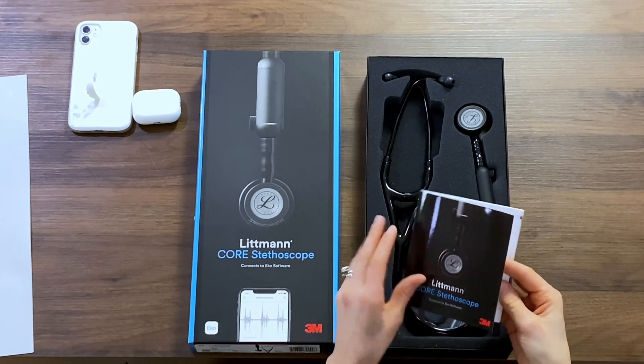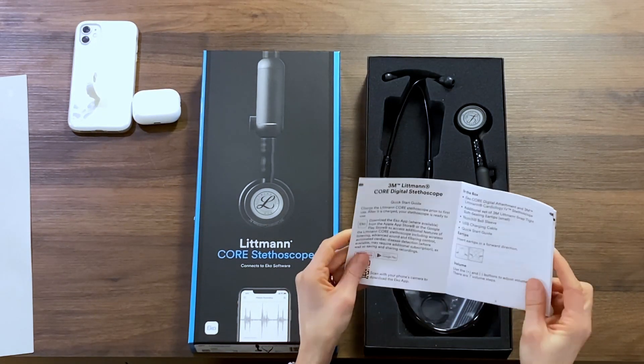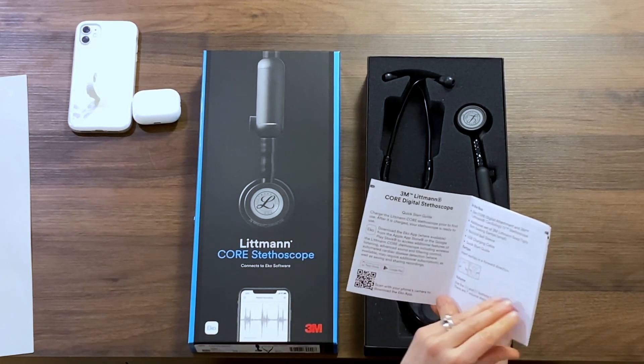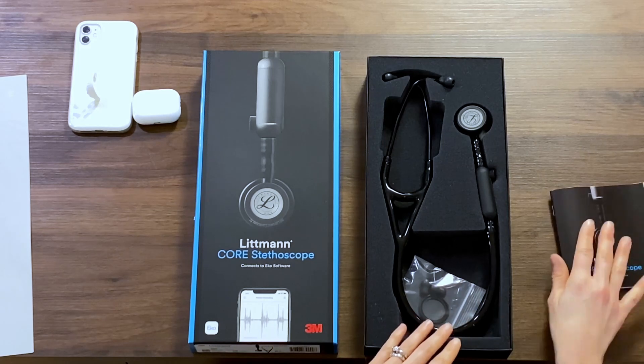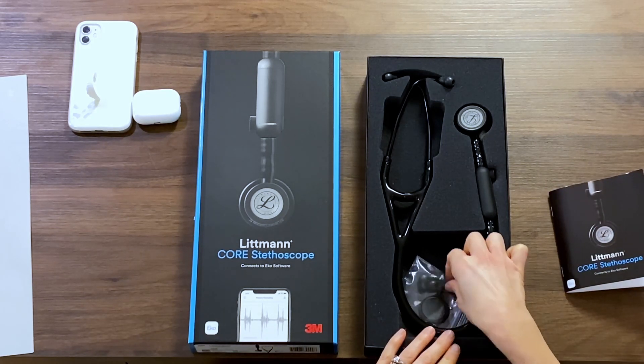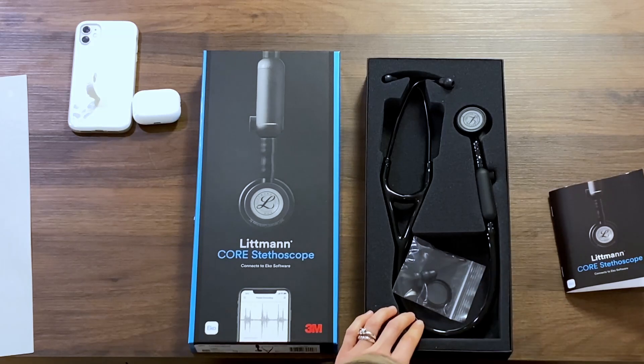So it comes with this easy user guide. It's not long and detailed at all when it talks about exactly how to utilize the product, which we can get into in a little while. It also comes with a set of two smaller attachment earpieces.